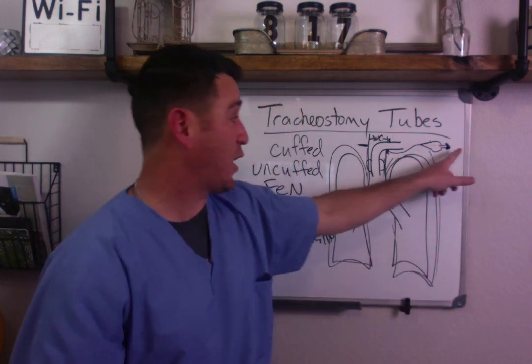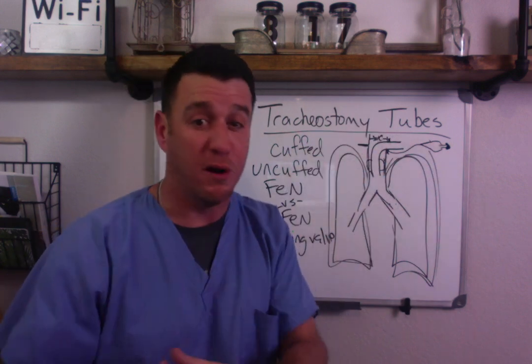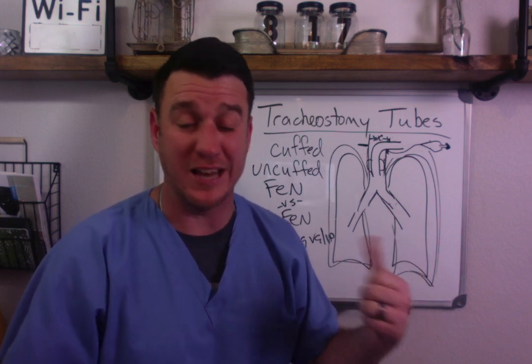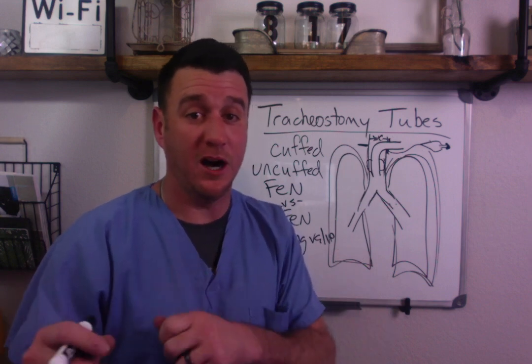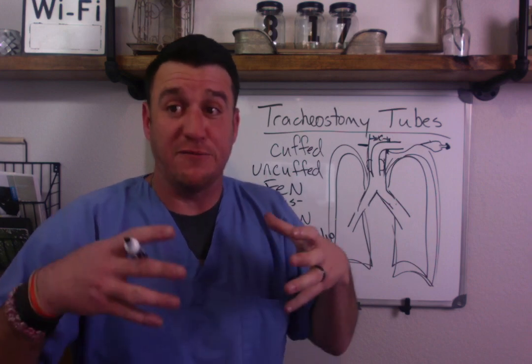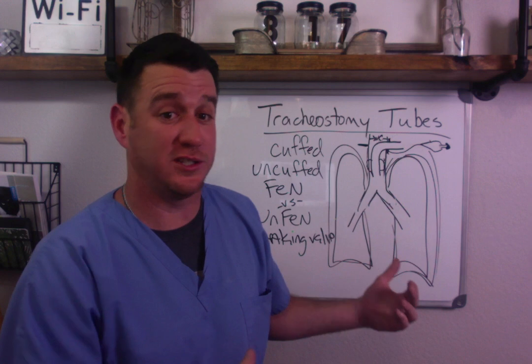and that'll keep air from coming back in to reinflate it. This is probably the single most dangerous trach you could have on a patient with a speaking valve. I would not recommend it, because a simple opening of the pilot balloon, the foam cuff inflates, and you're on a speaking valve, and now you've got the scenario we created just a second ago, right?